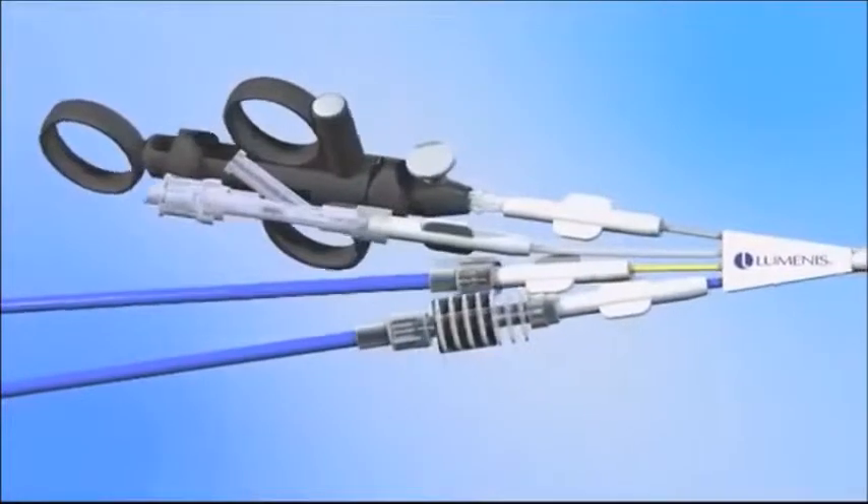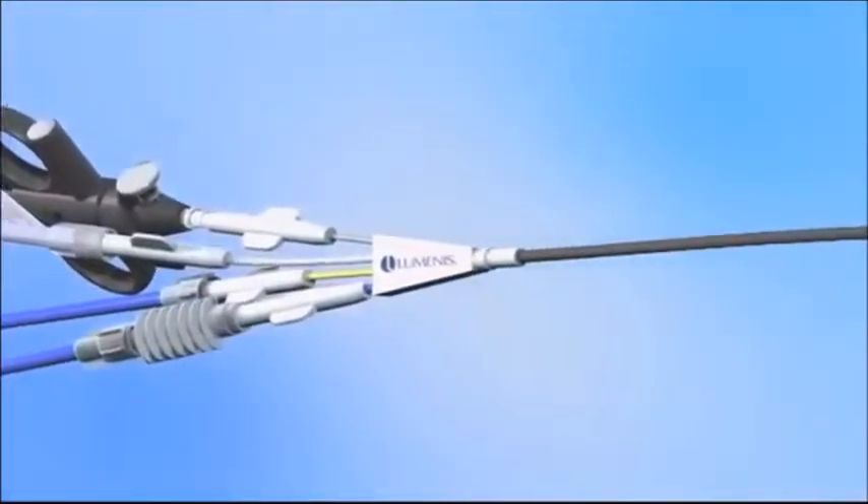The Poliscope is the first disposable flexible endoscope originally developed for gastrointestinal endoscopy but now adapted for endourological use. The Poliscope catheter body is only 8 French in diameter and delivers high quality images through a 10,000 pixel fiber optic.